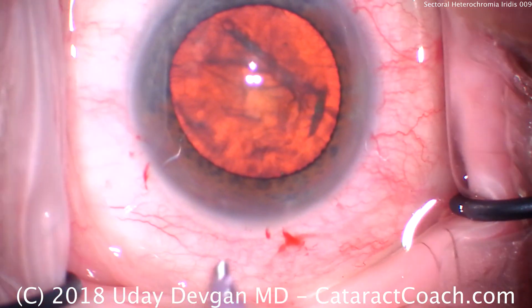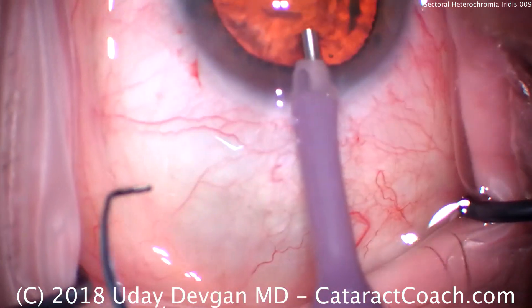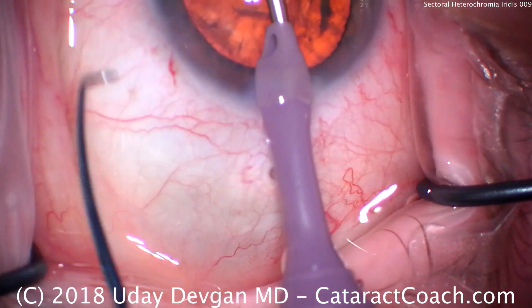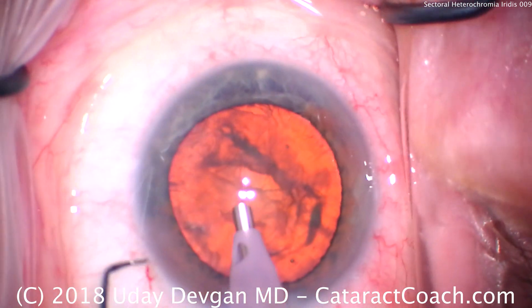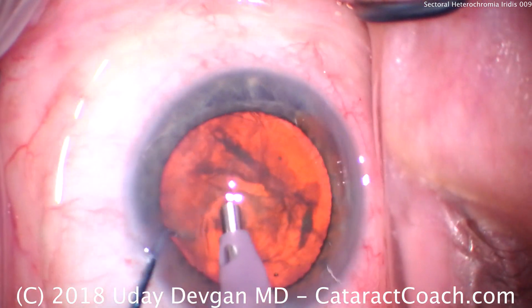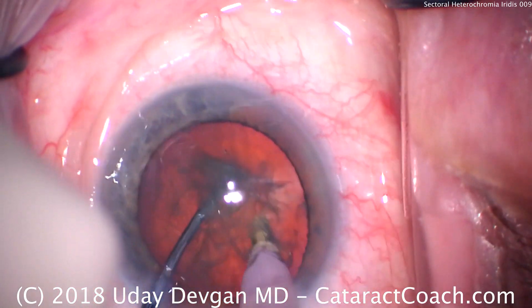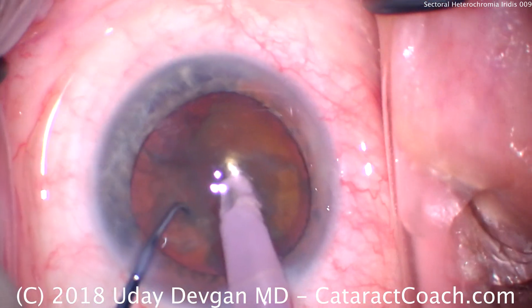We'll adjust our phaco tip to have enough metal showing. The reason is we need to have a good purchase on the nucleus in order to chop it. So we'll put the phaco probe in the eye, chopper's going in via the paracentesis, buzz the probe in, dig the chopper in, and break to two halves. Now we have two halves, and we separate them fully.